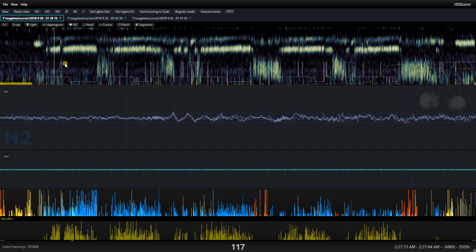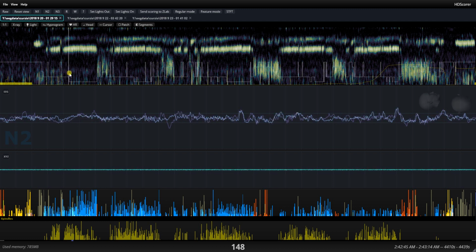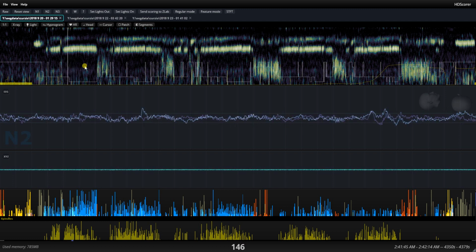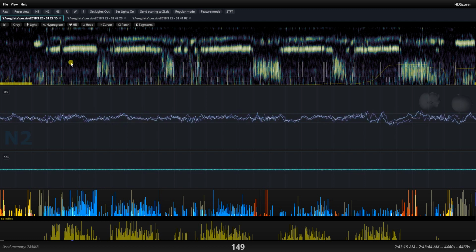If it has to have any significance, you should mark the N2 and N3 point at the most likely phase change point. This is still not optimal, and it's only something I'm doing to keep with AASM rules, because this is fiction, the idea that there's going to be an N2 state and an N3 state. There's a continuum that I don't have open right now, but I can show you in another video. There's a continuum of sleep depth between N1 and N3. And so you can imagine that this staircase graph, this sudden, in fact, here I can show you, N2, N3. They don't look that different because they're not that different.